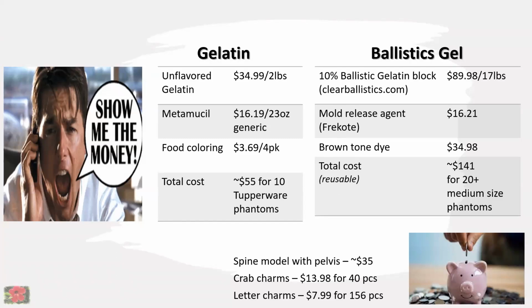Yeah, so you don't melt the entire block at once. You just cut slices as if you're cutting toast. And then with my hand, because it's faster, I just cut it into small pieces. That just minimizes the time to melt in the oven.